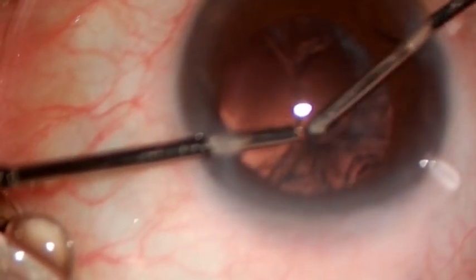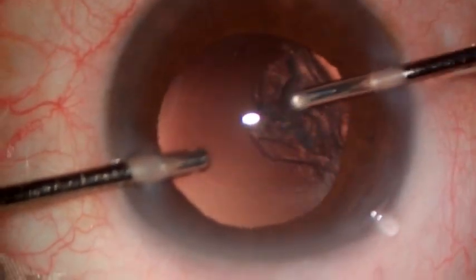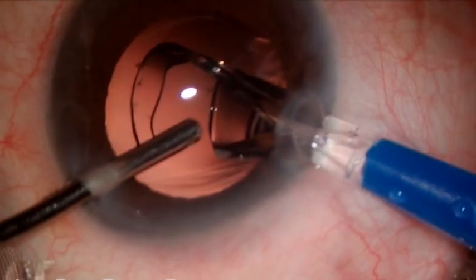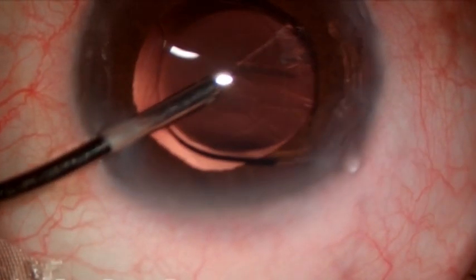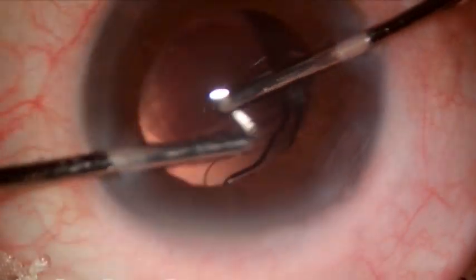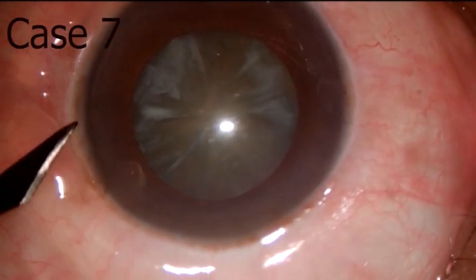The basic advantage of doing CCC under irrigation is maintenance of the anterior chamber. The irrigating probe acts as a second hand to keep the CCC flap folded and helps in natural curvilinear shearing force, which is particularly helpful in mature cataract.